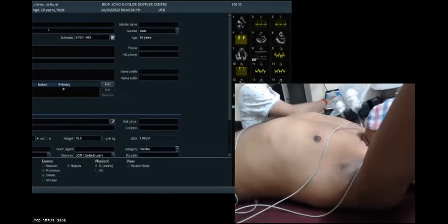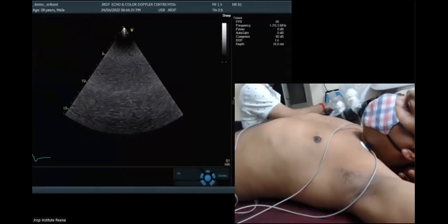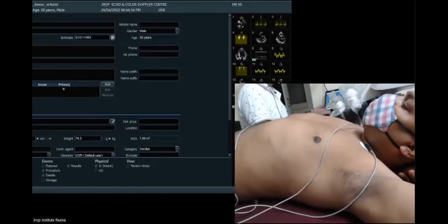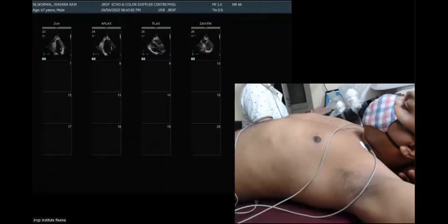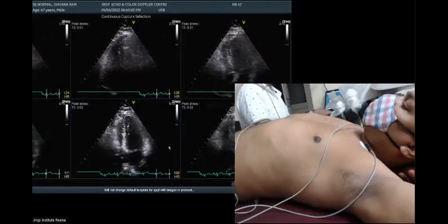Give me a second, I'll give you the answer, because till these machines change, I'm not going to change. Three nomenclatures have been labeled over a period of time, but the problem is they have not been adopted by machines. Give me a second, I'm going to show you what exactly I mean.